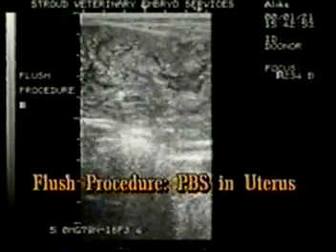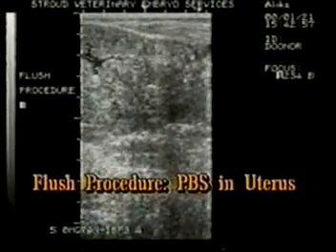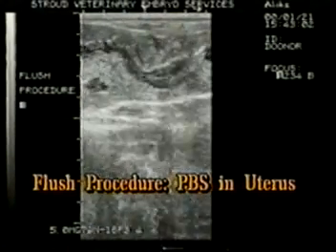This is an illustration of an actual flushing procedure. The blackened area represents saline entering and exiting the uterus. The echogenic specks in the saline are endometrial tissue.